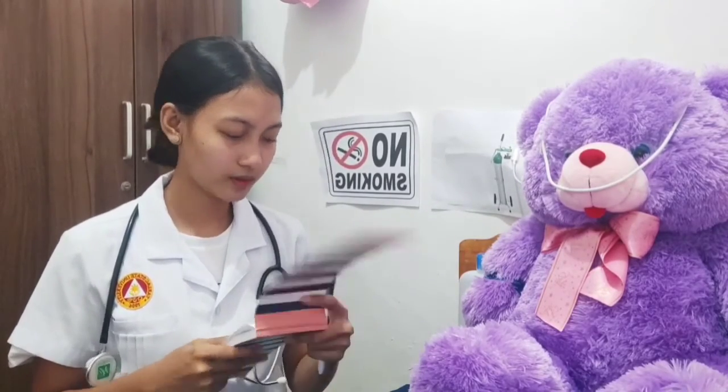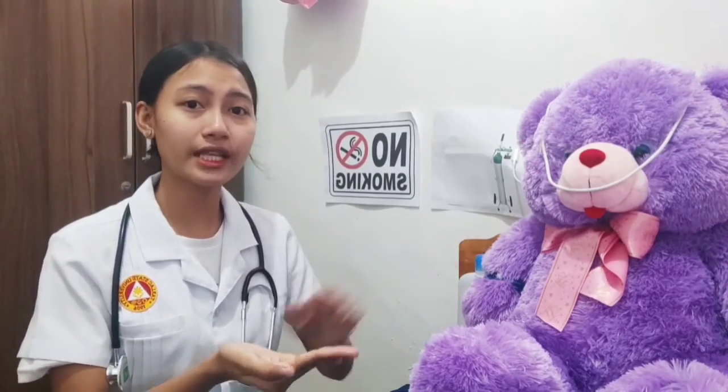For the evaluation, we perform follow-up based on findings that deviated from the expected or normal for the client, relate findings to prior data if available, and report significant deviations from normal to the primary care provider. Thank you, ma'am, for cooperating with us for the procedure. Don't forget to use alcohol to sanitize your hands. That's all for today, thank you.